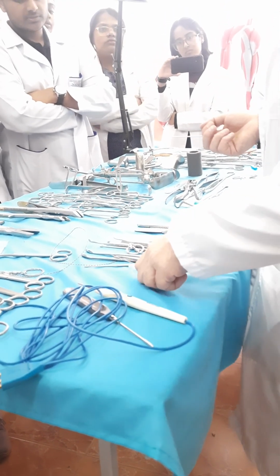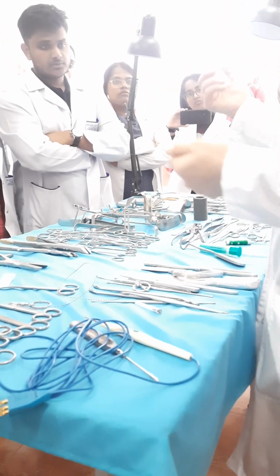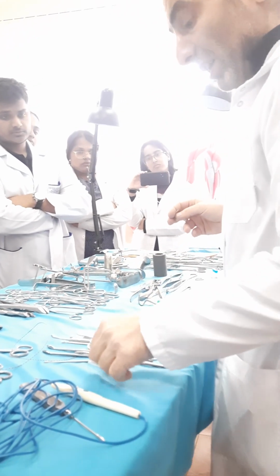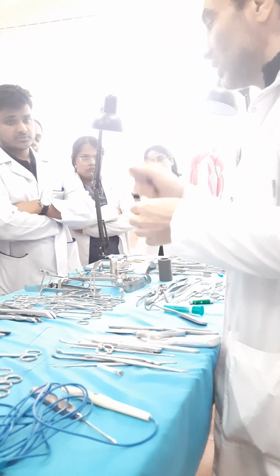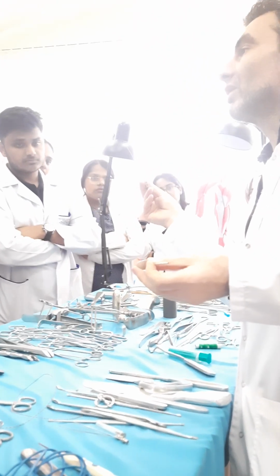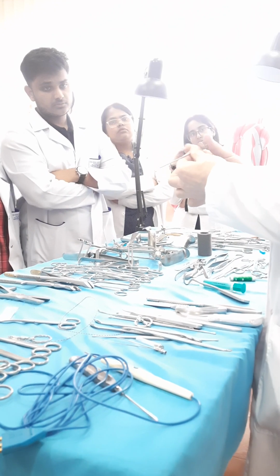Primary, there are injection needles. Secondary, there are puncture needles. And a special needle, which we call the lumbar puncture needle. The lumbar puncture needle differs from ordinary puncture needles because inside it there is a special wire, which we call the mandrin. The mandrin has one function: it protects the lumen during your puncture.